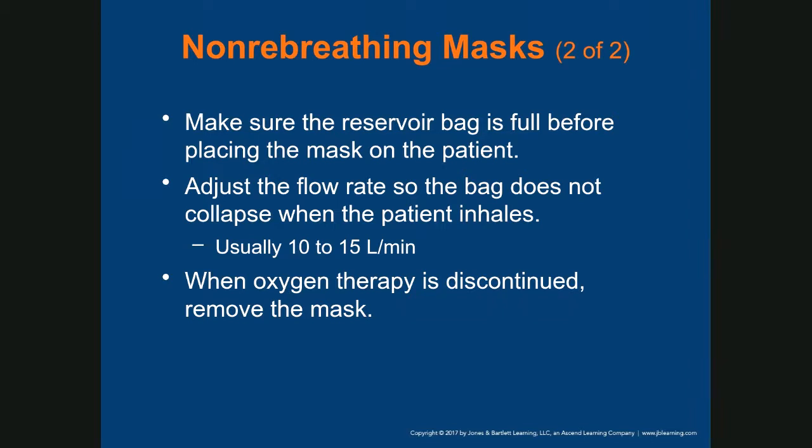Because the machine will be the only source of oxygen the patient gets. None will be coming in from the air. Right, good. So it's called a non-rebreather. It means the patient cannot rebreathe outside oxygen. They can only breathe the oxygen that is coming from the tank. So if you turn off the oxygen, the mask will completely form a seal on the patient's face, and they can suffocate. So remove the device first, turn off the oxygen after.